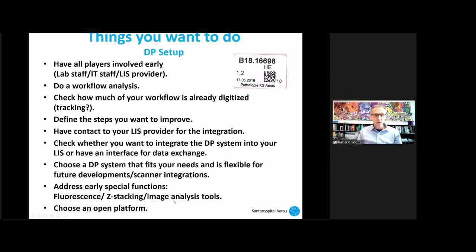Finally, you don't want to work with 2, 3, or 4 softwares on your workstation. Ideally, you have the scanned slide, you want to review that, and then you want to use analysis tools, either image analysis or artificial intelligence, but you don't want to switch between various softwares back and forth, because that's not very convenient. So talk to your DP provider, how are these analysis tools implemented?